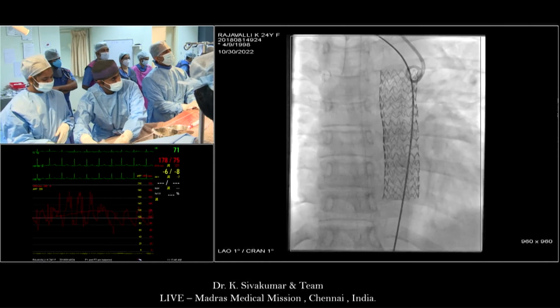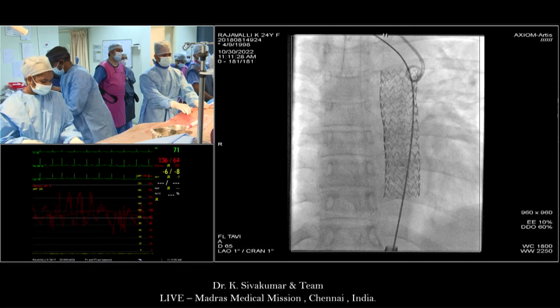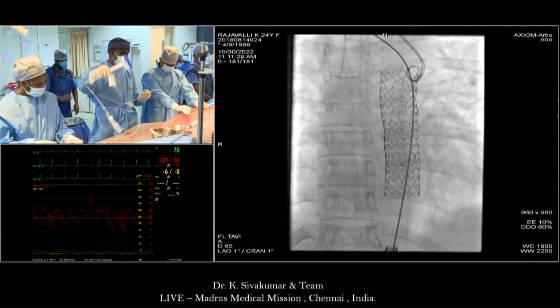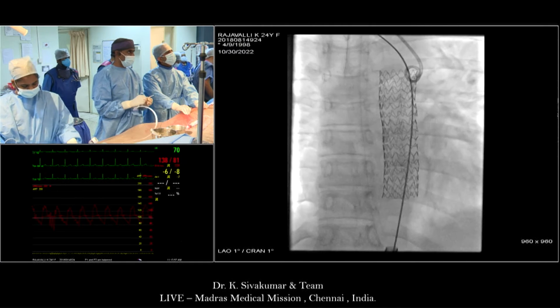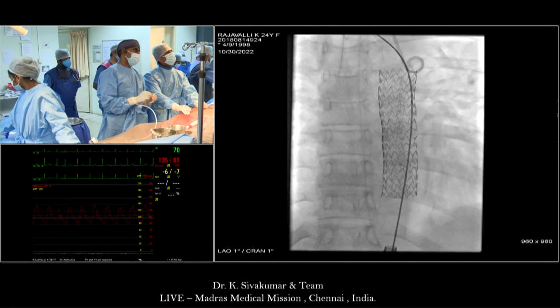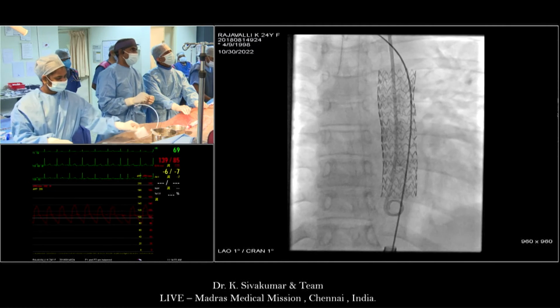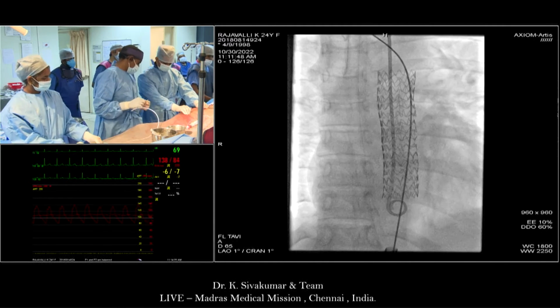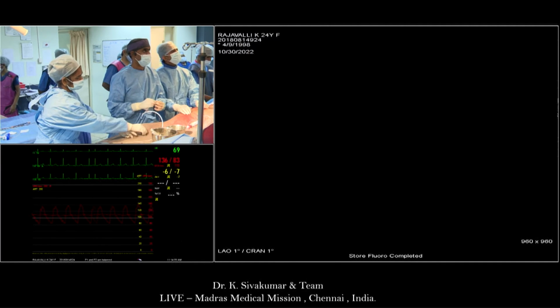Ashok, is it possible Shiva, that you can advance show us very quickly, we gotta move on. Yeah. Shiva, we have to move on. So you have 30 more seconds, whatever you want to show us now. Yeah. Please. So I am now loading. Yeah. Okay. Inject now. Correct. Push it in. Push it in. Correct. Keep pushing. Keep pushing. Stop there. Stop. Ready for injection? 1 second. Shoot.